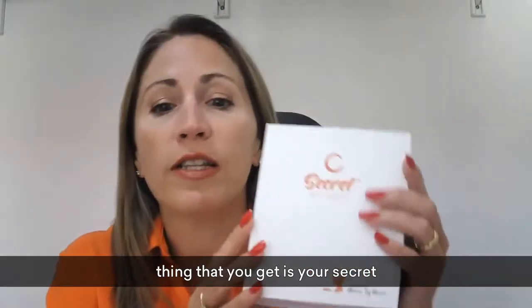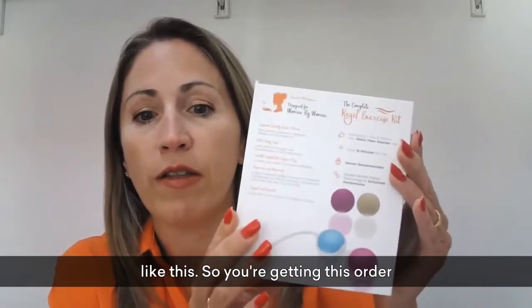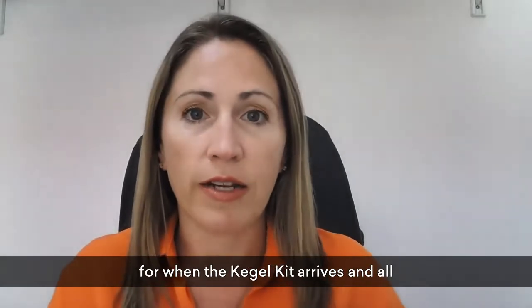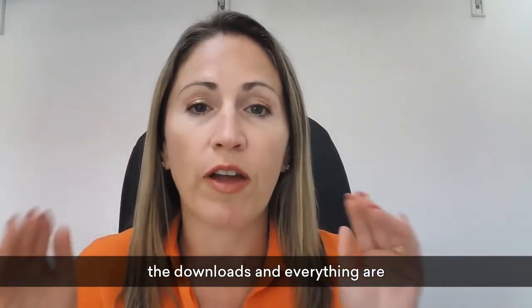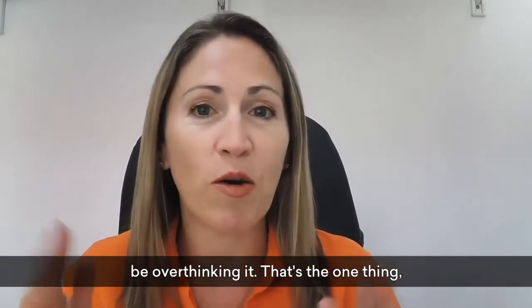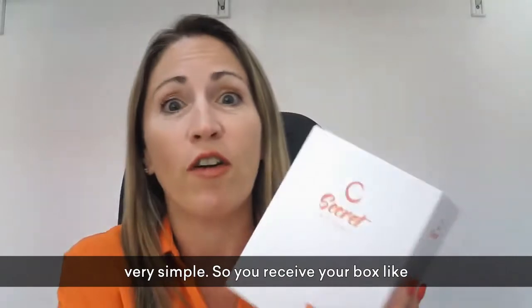The first thing you get is your Secret Whispers kegel kit — it'll arrive like this. You're getting this order confirmation email now, so you're ready for when the kegel kit arrives. All the downloads and everything are attached to this email, so as soon as it comes you're ready to go and you don't need to be overthinking it. Please don't overthink it — it is very simple.